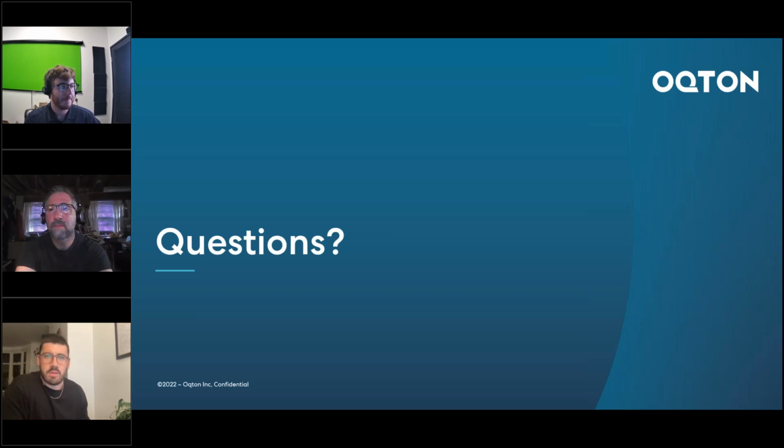Thank you, guys. That was super interesting. We've got a couple of questions here that have been asked just as we've been going through the presentation. This first one, does Freeform integrate directly with scanners?